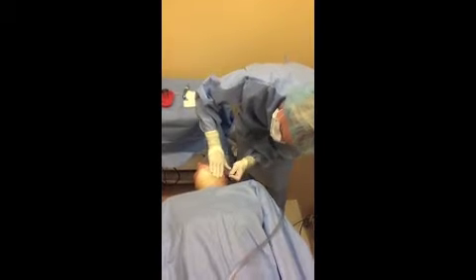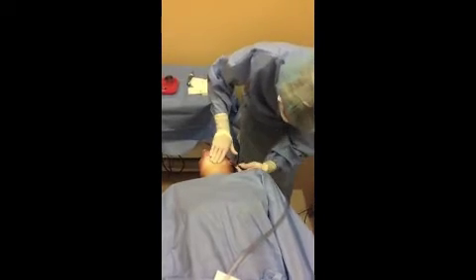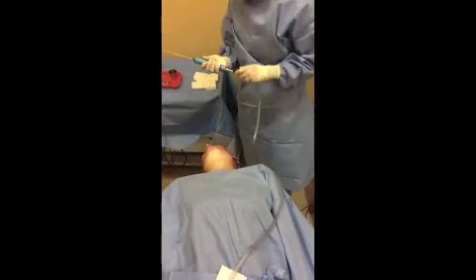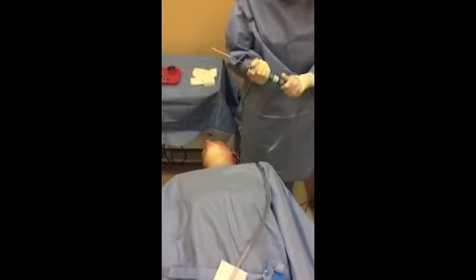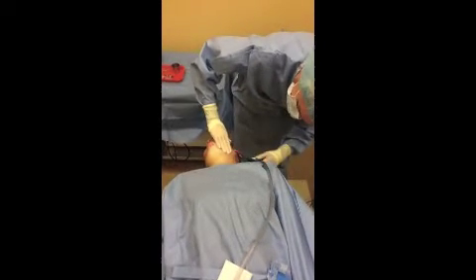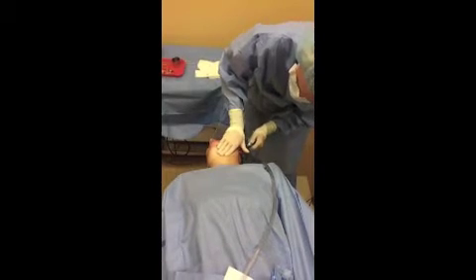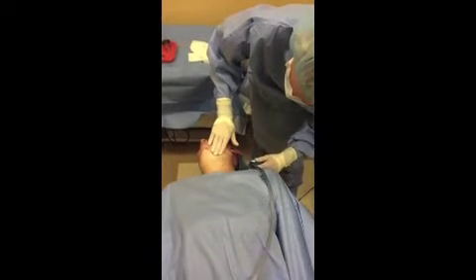You've got a tiny little neck. I know. And now it's going to be tinier. Now it's going to be tinier, that's right. Cannulas to this one, it's easier to handle. Are you catching all the exciting moments? That's shaping Mary's neck. Zoom in a little bit there.